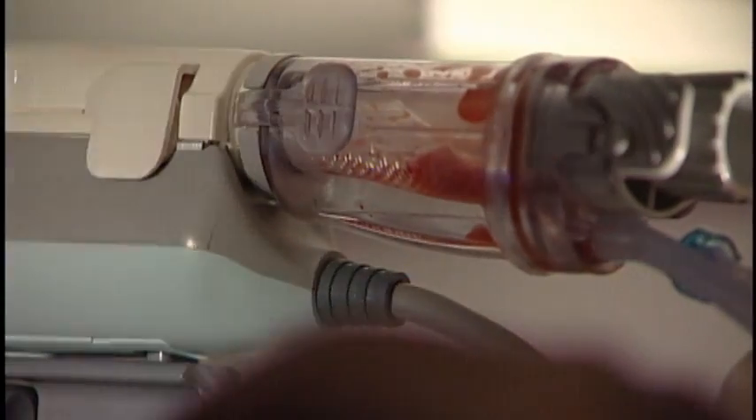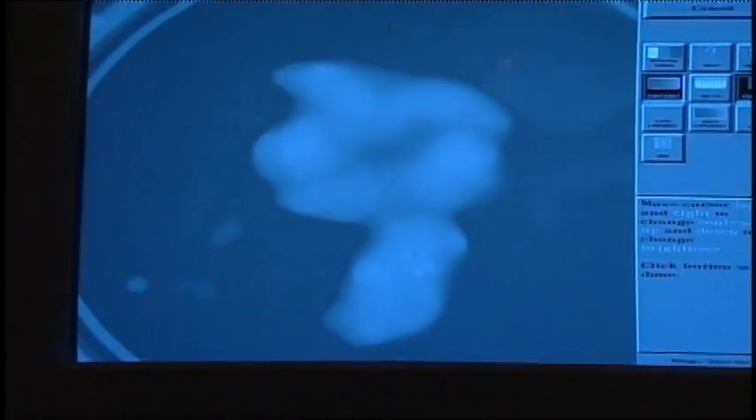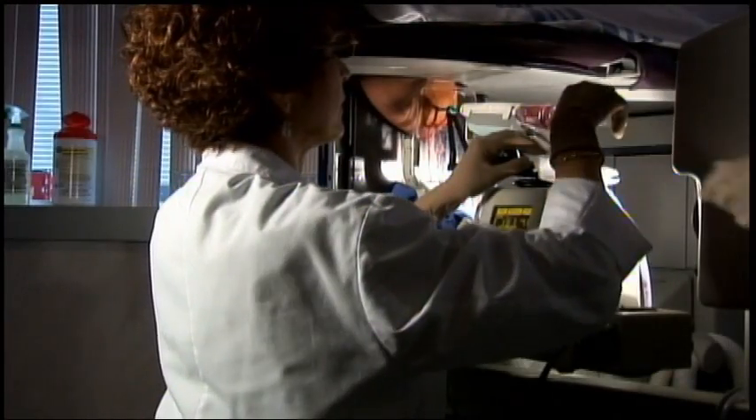Now we've taken our four samples and we're going to check our specimen for calcifications. Here's our specimen x-ray and you can see the calcifications in the tissue. We've obtained our sample and we don't need to take any further samples.